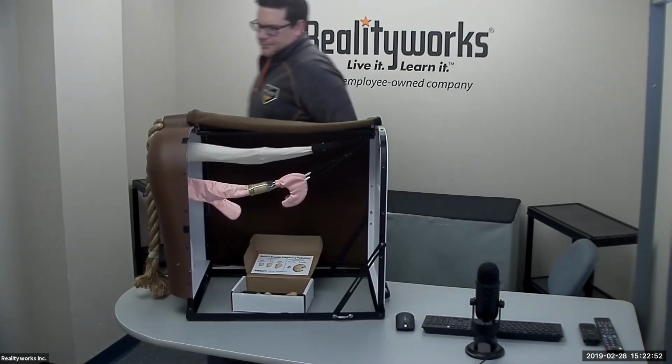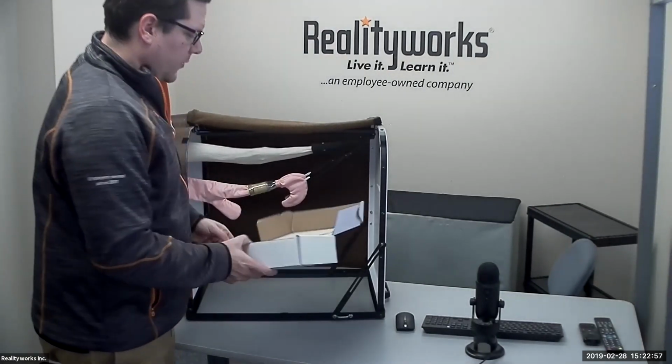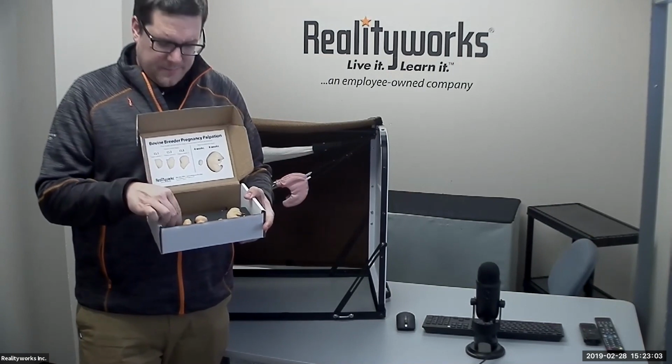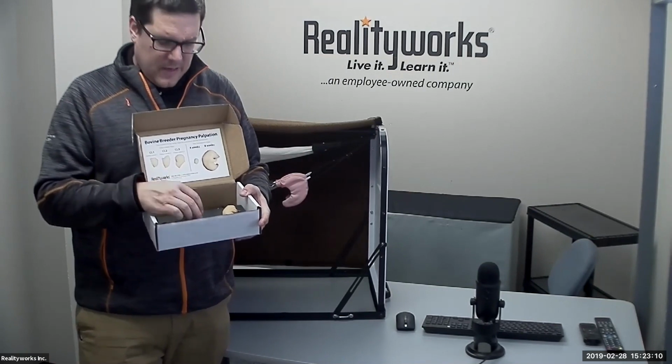I have our different insemination and pregnancy palpation pieces here. You actually have these in different sizes, and with each size, as they get bigger and bigger, you can see them and talk about it.